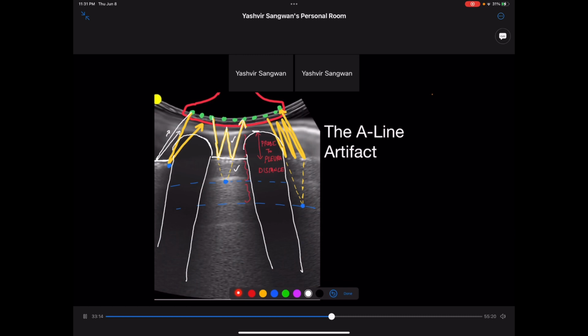Again, because the crystals don't realize this is happening, and the time taken for this wave is double the time taken normally, this piezoelectric crystal will think that this sound came from double the distance. And if it happens 3 times, it will think it has come from triple the distance.